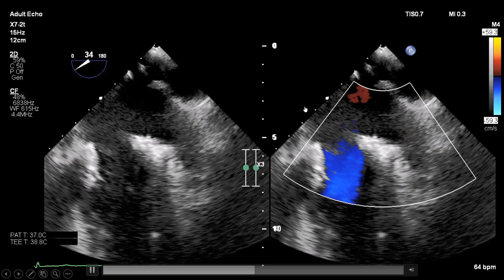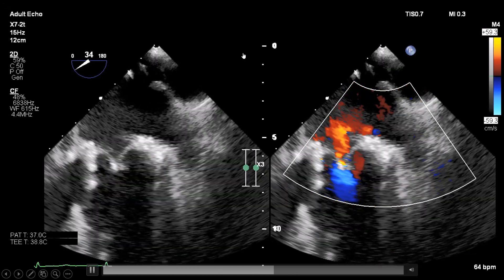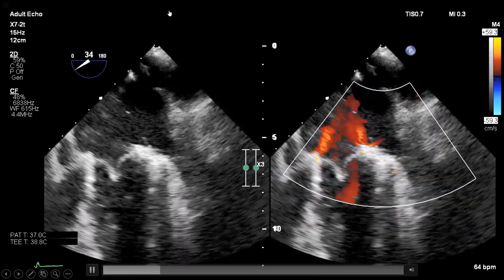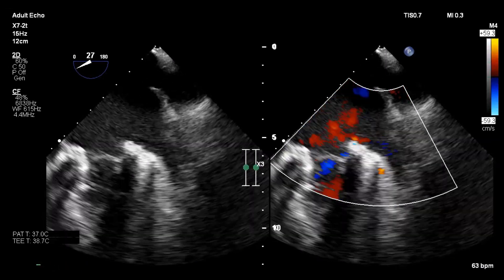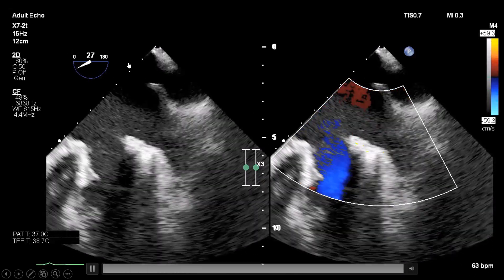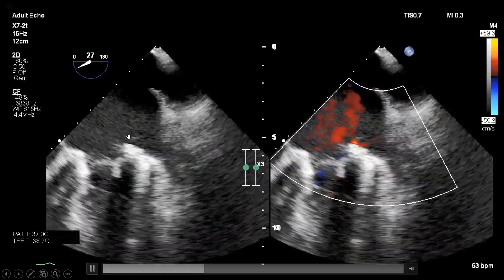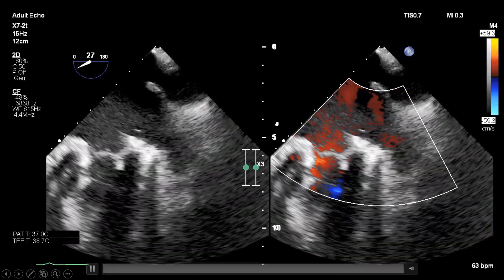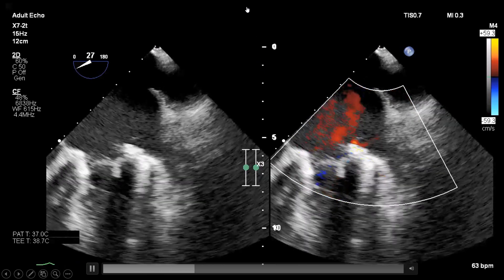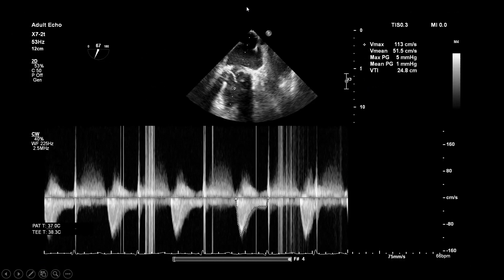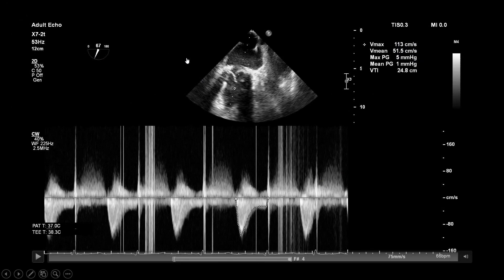This is the assessment in 2D with color for the newly implanted Edwards SAPIEN valve within the old bioprosthetic mitral prosthesis. You can see the leaflets are now opening very well. The left atrial appendage is here and clear. With color, there are tiny subparavalvular regurgitation jets — laminar flow, not high-velocity — that go away quickly after stopping and reversing heparin. Sweeping the angle from 0 to 180 confirms no significant leaks. The mean gradient, previously 10 mmHg, is now 1 mmHg across the newly implanted prosthesis.